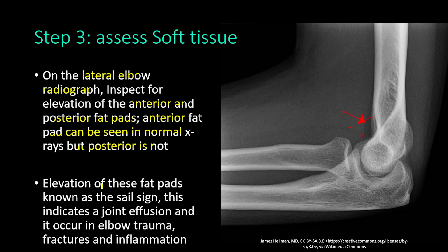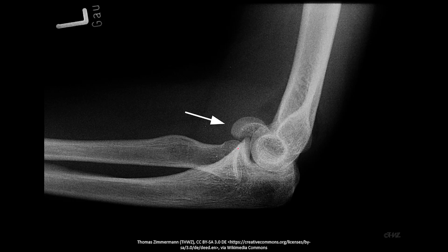The fat pads are only seen on lateral elbow x-rays. Elevation of these fat pads is known as the sail sign and indicates a joint effusion. This occurs in elbow trauma, fractures, and inflammation — in these conditions the elbow joint bleeds, fluid collects, and pushes the fat pads away from the joint, causing their elevation.